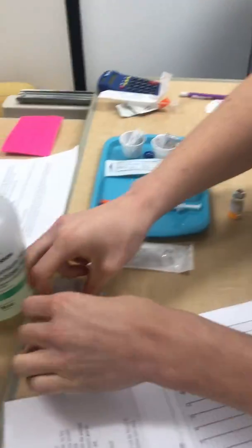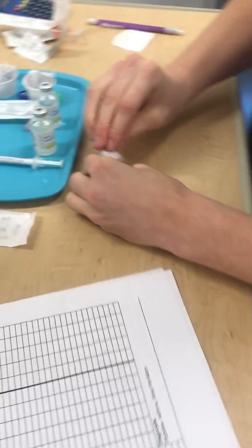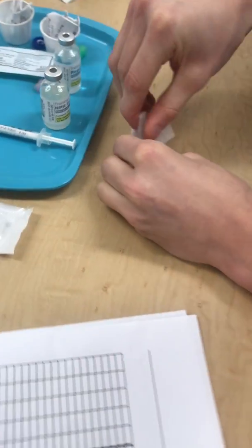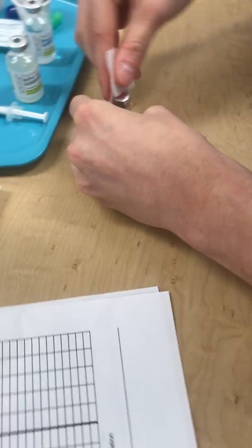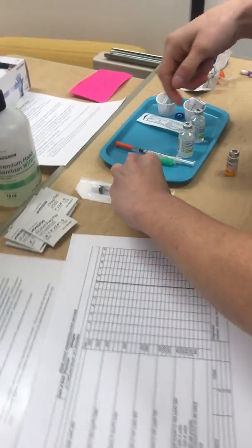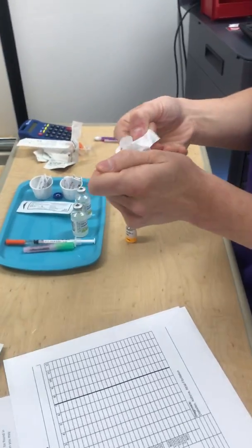And then we're going to clean it with an alcohol pad, the top of it, for about 10 to 20 seconds. So 4, 14, 20, that's about 20 seconds there. And yep, not expired, no allergies, that's all good. So then I'm going to open this. Let you see that, and just so you know, none of my equipment is expired. I checked all the boxes for the expiration date.